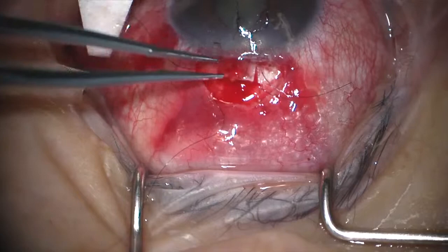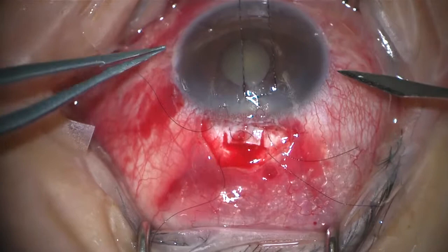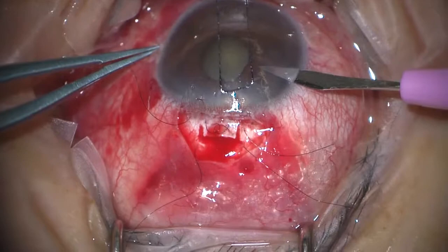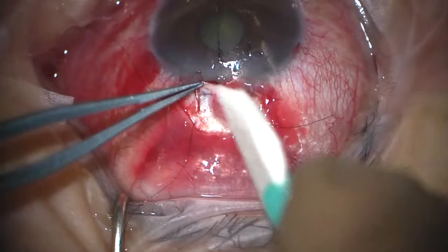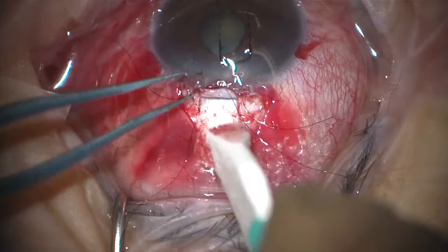Good. So before you ever enter the eye, paracentesis, so we can always refill the anterior chamber. And that's always a good thing, that if the pressure preoperatively is very high, you can do a paracentesis and then wait a few minutes and just slowly release some aqueous to reduce the pressure before you make the sclerostomy.